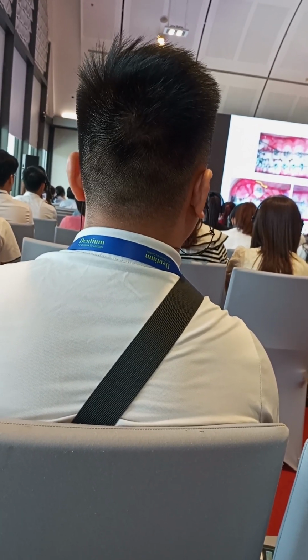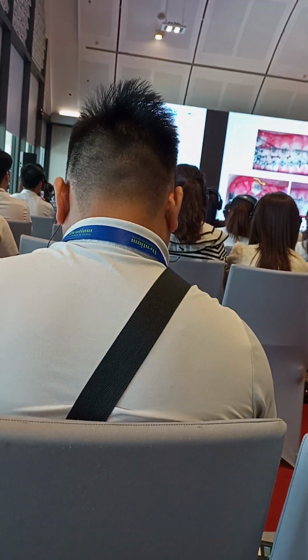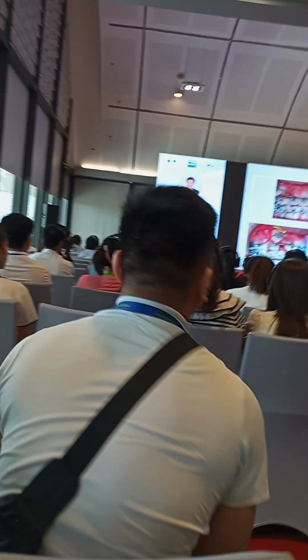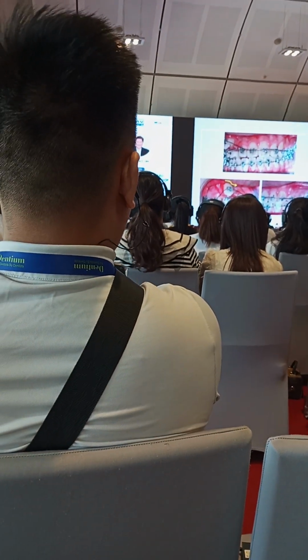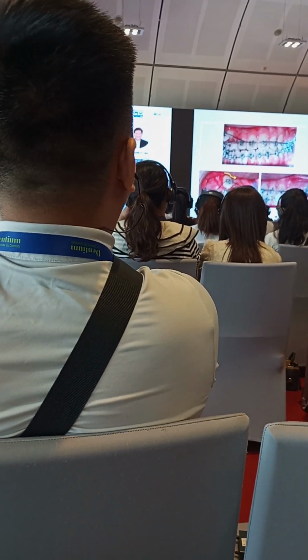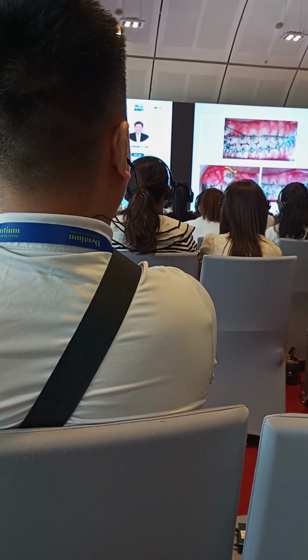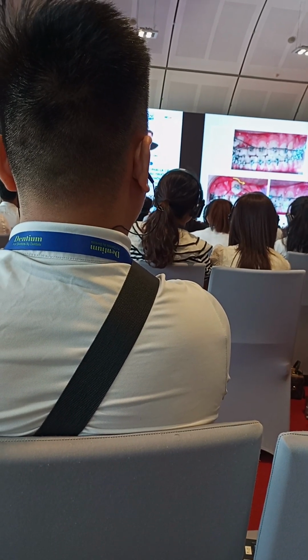I was doing this particular mechanics, if you try to look at this particular area, I placed a lingual root torque on my premolar because I wanted the root to go lingually so that there will be enough space for my canine to pass through the root.